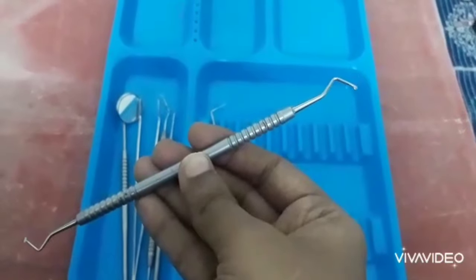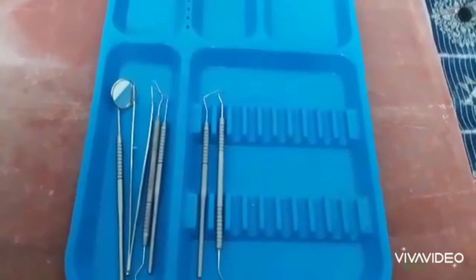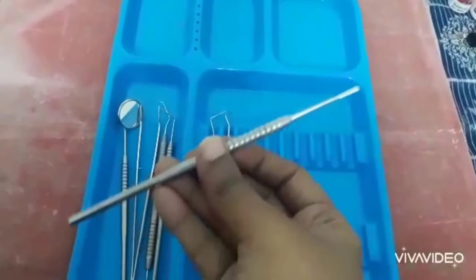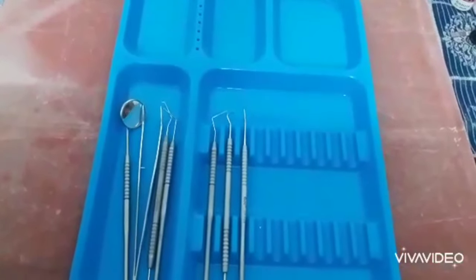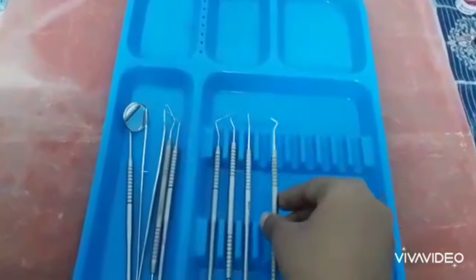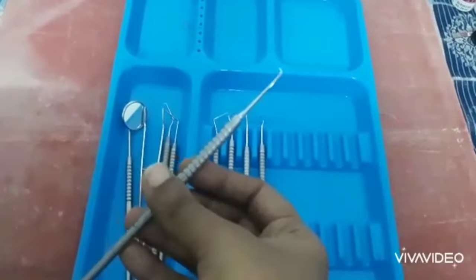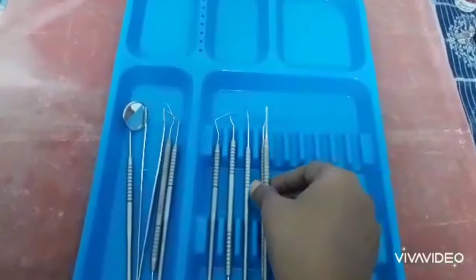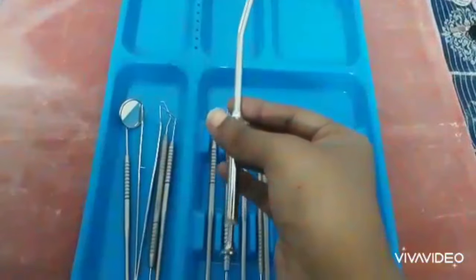Then, a spoon excavator. All these are cutting instruments. And one straight chisel, and the enamel hatchet. Now we arrange the Mesial and Distal Gingival Marginal Trimmer. All these instruments are cutting instruments.